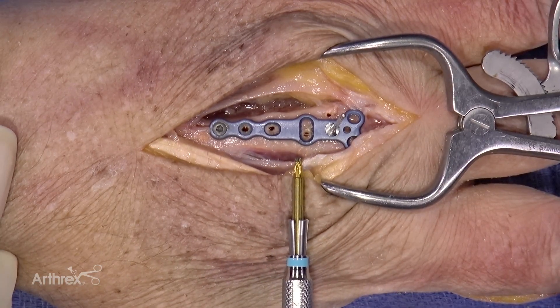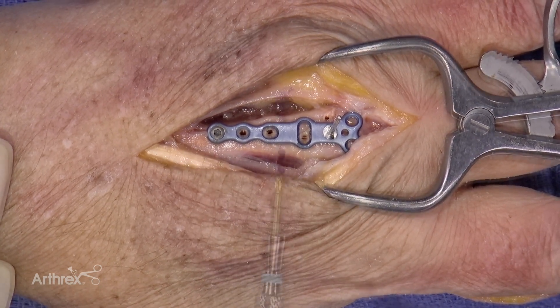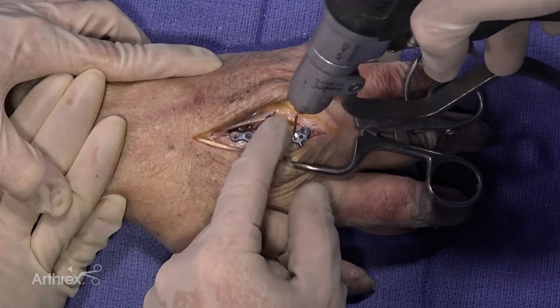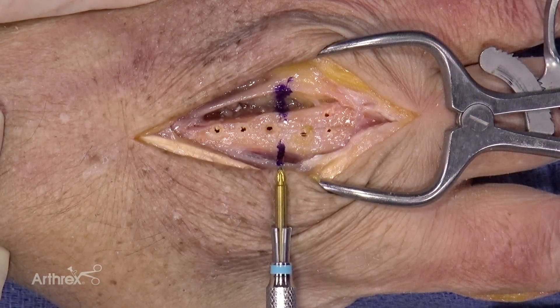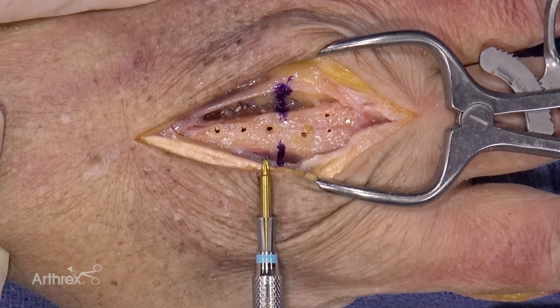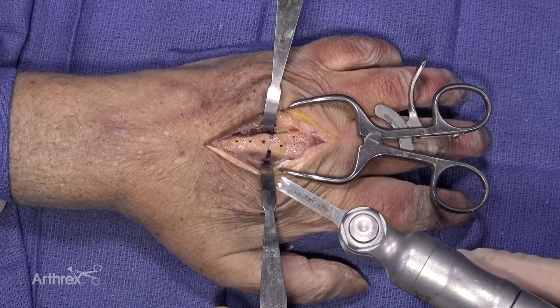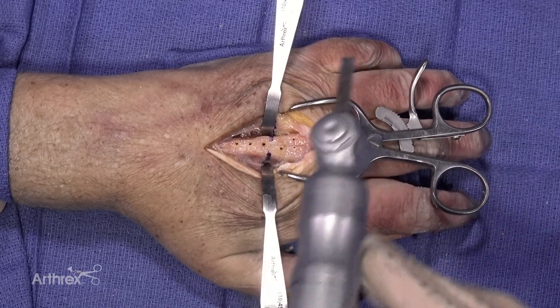The location for the osteotomy in this plate lies between the oblong hole and the three holes in the straight portion of the plate. Slight angular correction can be made through this osteotomy by making it non-parallel to the joint line. The final BB-TAC is removed and allows us to remove the plate from the bone. The location of the osteotomy lies between the oblong hole and the distal most portion of the straight plate. For sake of expediency, we're using an oscillating saw to complete the osteotomy. In a real patient, you may choose to do a low-energy osteotomy via bicortical K wires and osteotomes.